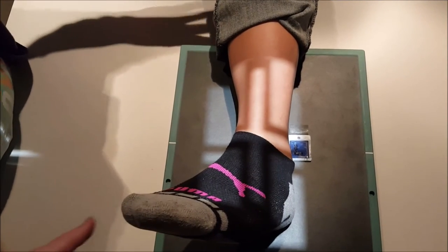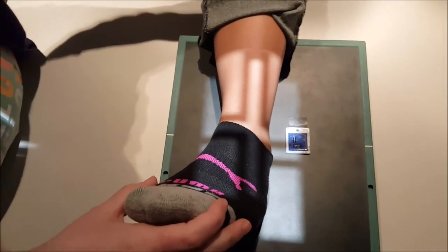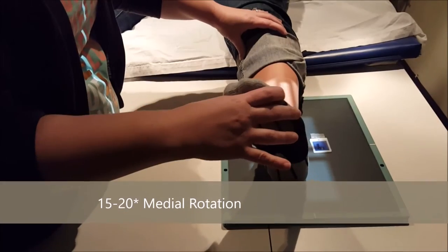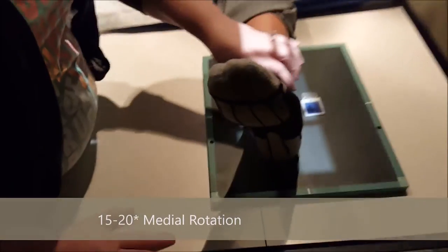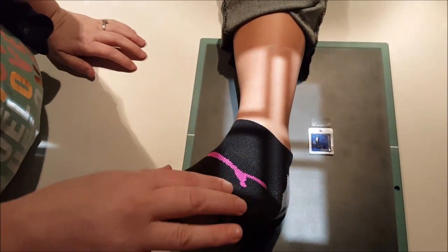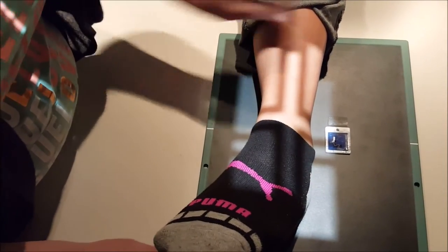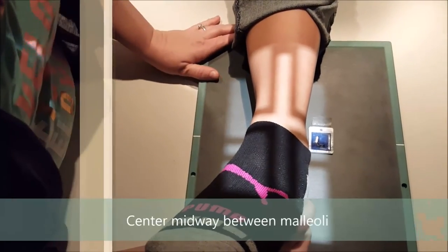For an oblique that's going to show the mortise joint, from AP you're only going to go 15 to 20 degrees. What that's going to do is open up the joint space. I like to just let the toes drop — it opens up the joint space a little bit better.